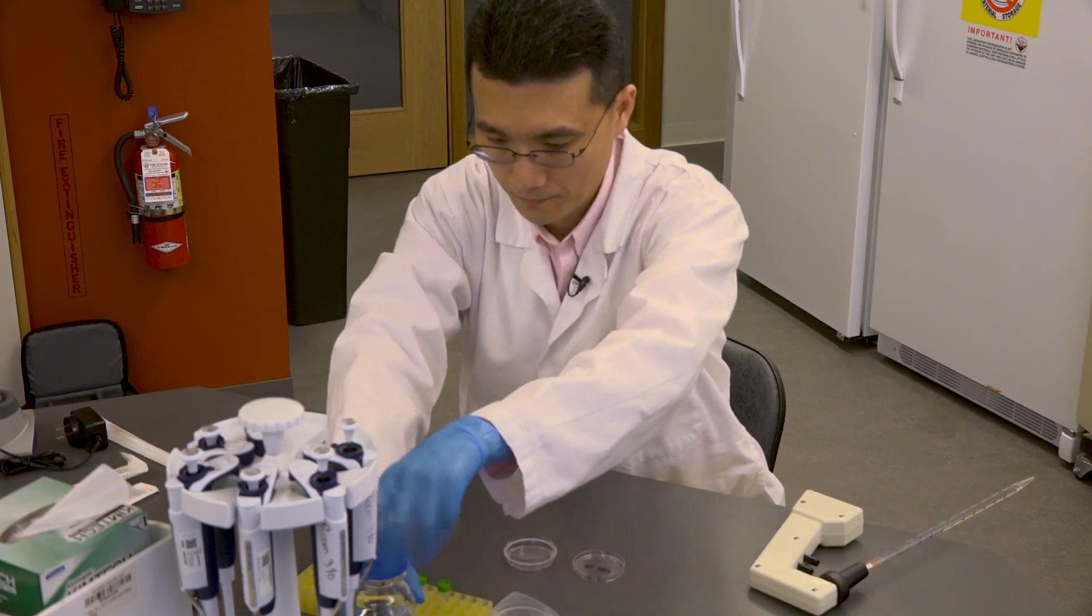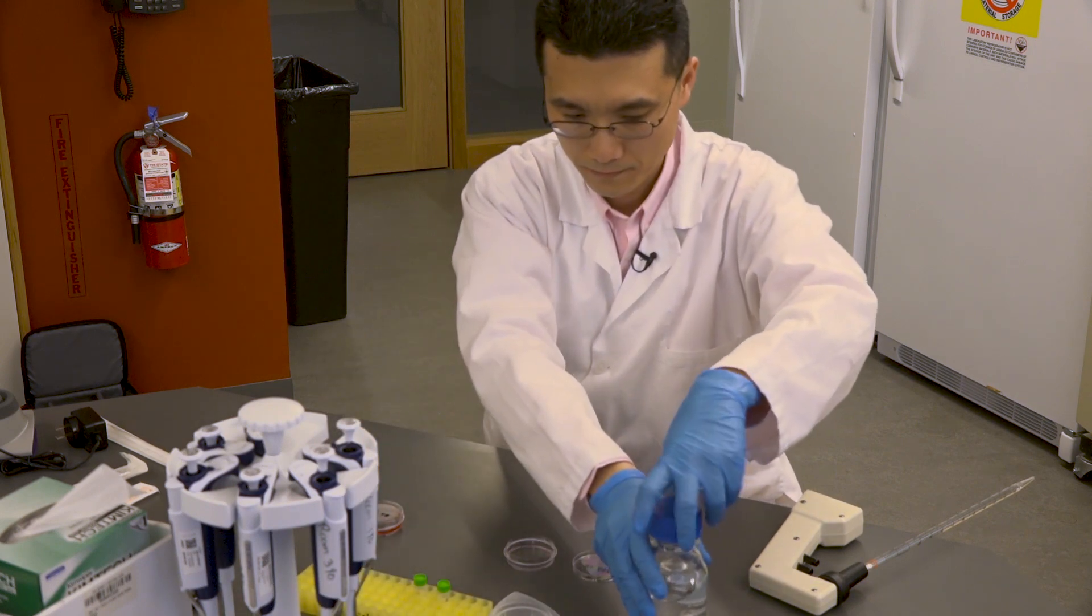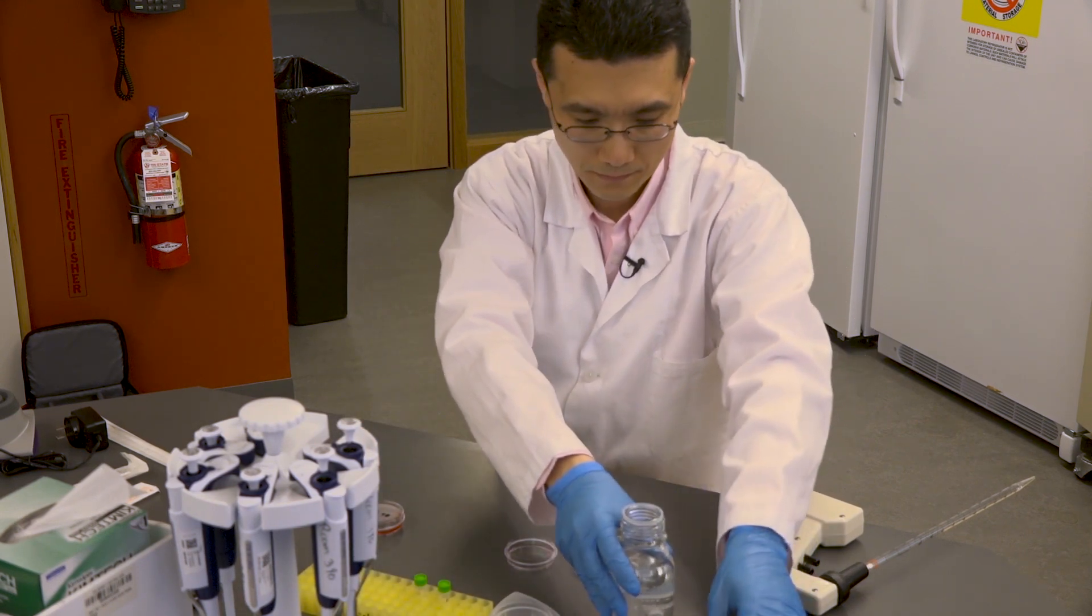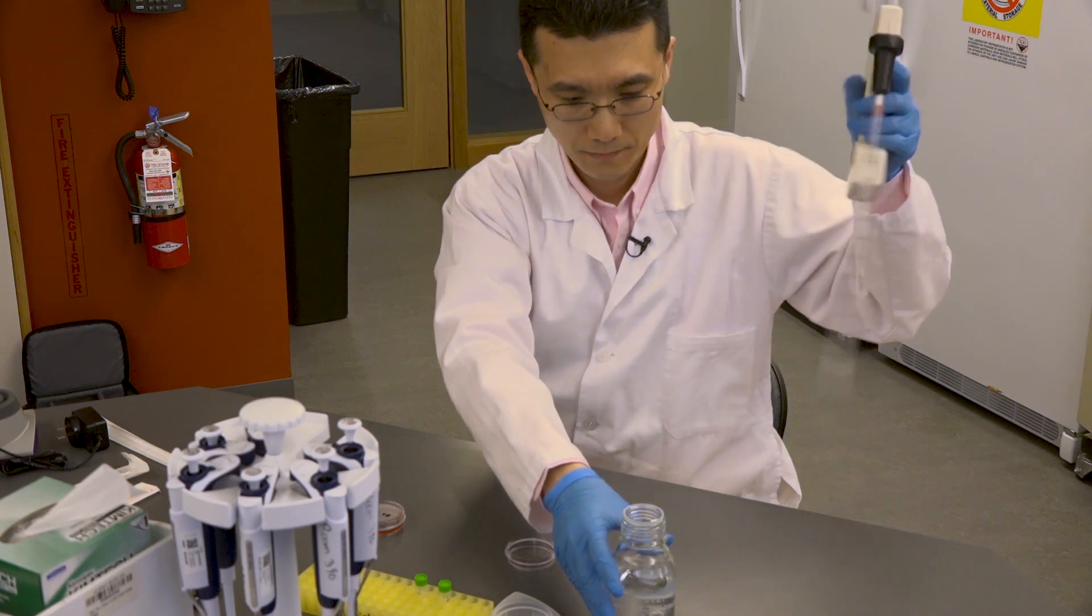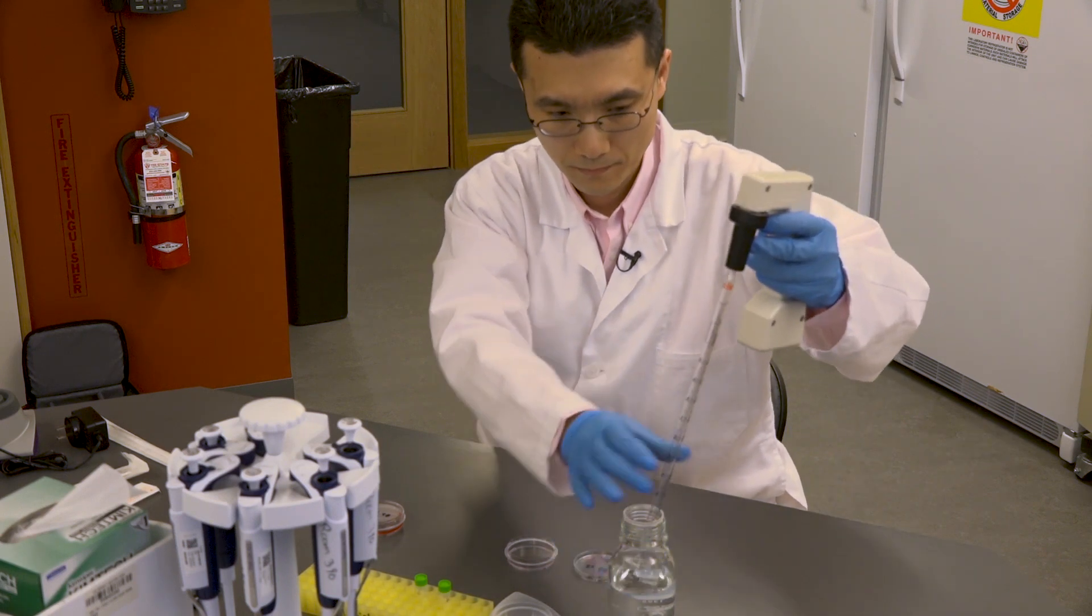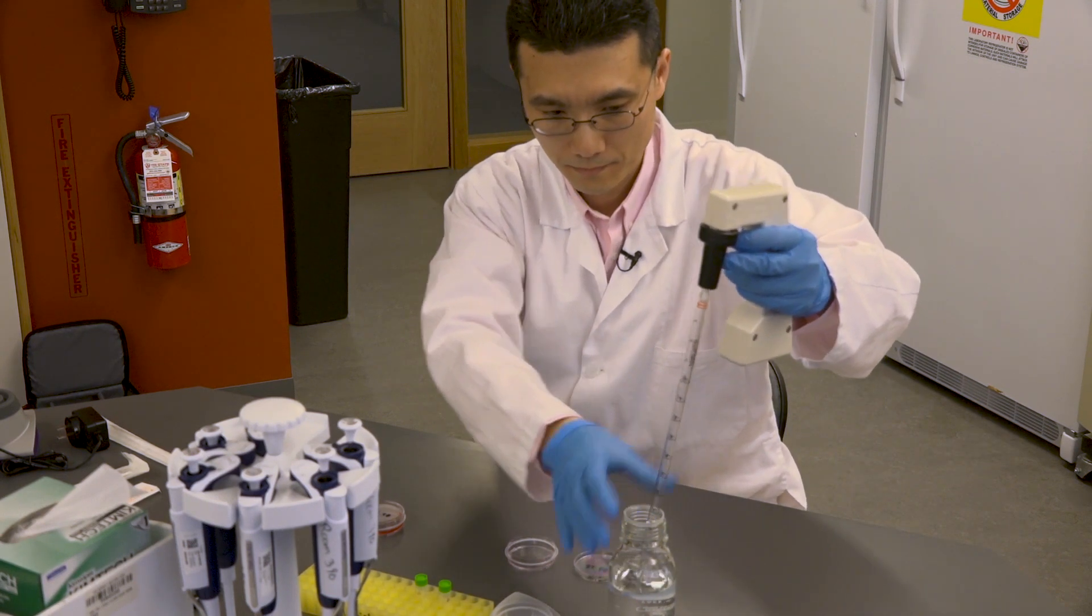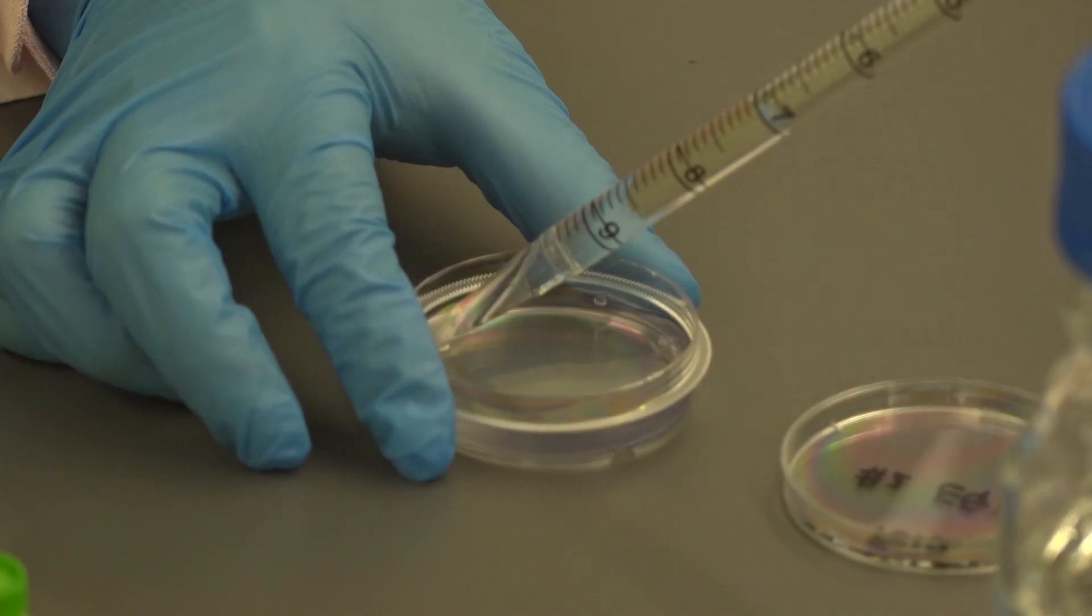To do the wash, simply pipette 10 milliliters of TBS into a 10-mil serological pipette. Dispense 5 milliliters into one dish and the remaining into the other dish.